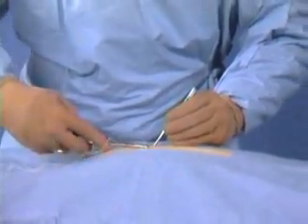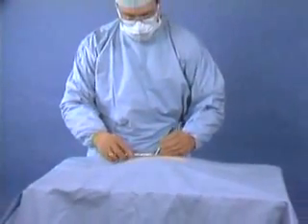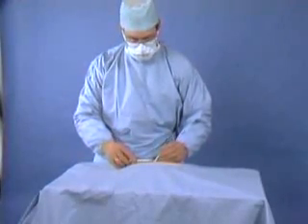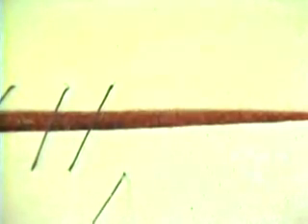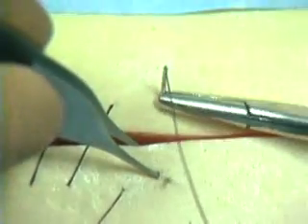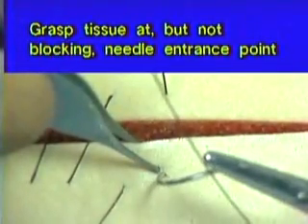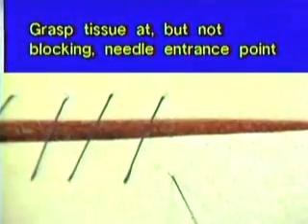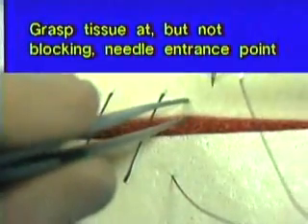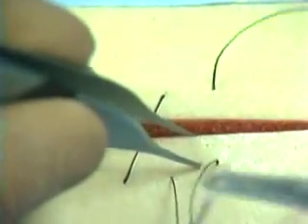When placing a stitch, you should hold both elbows wide and approach the wound from opposite sides with your two hands. This allows maximum maneuverability with both hands and arms without feeling cramped or awkward. For the most part, the tissue that the needle will immediately enter should be grasped with the forceps first. Hold the tissue comfortably close to the desired needle entrance point, but not at the point so that the needle is blocked. Once the needle has penetrated the tissue, the forceps can be released and used to retract tissue to expose the needle exit, if needed.